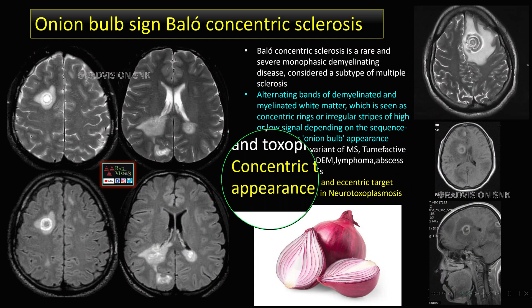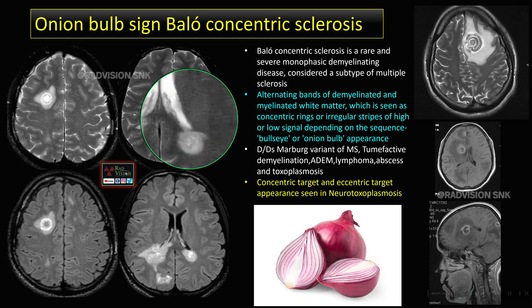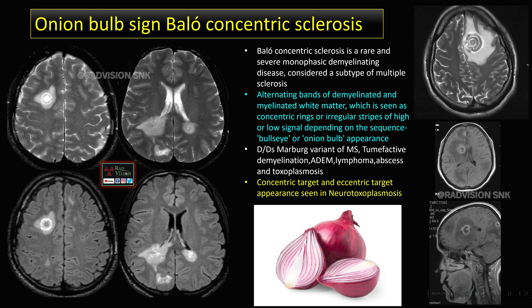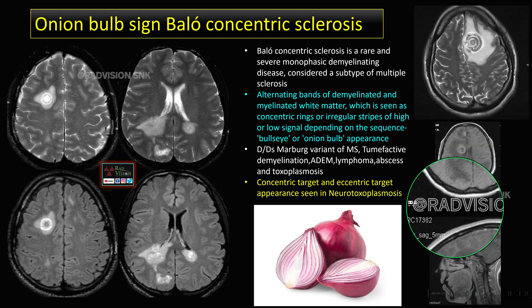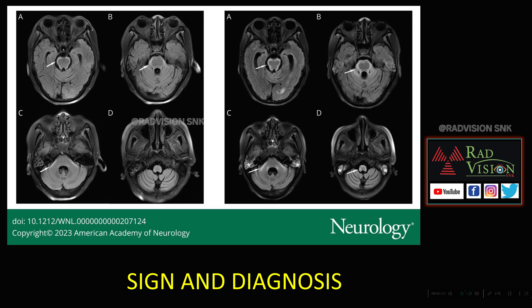Next case — guess the sign and diagnosis. Here you can see multiple alternating hyperintense and hypointense areas in a laminated appearance. These alternating bands represent demyelinated and myelinated white matter, which resembles concentric rings — the onion bulb appearance. This is classically seen in Balo's concentric sclerosis. Other differentials include Marburg variant of MS, tumefactive demyelination, ADEM, lymphoma, abscess, and toxoplasmosis. A similar concentric or eccentric target appearance can be seen in neurotoxoplasmosis. Whenever you see alternating bands of demyelinating and myelinated white matter with perillesional edema in the periventricular location, definitely suspect Balo's concentric sclerosis — this is called the onion bulb sign.